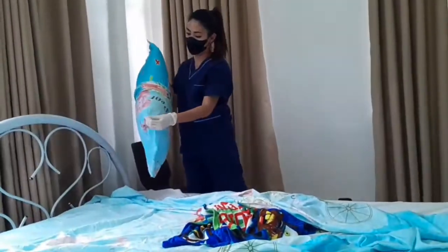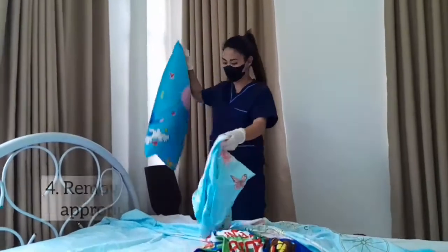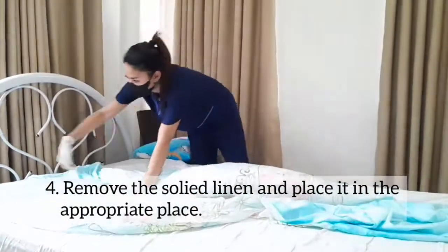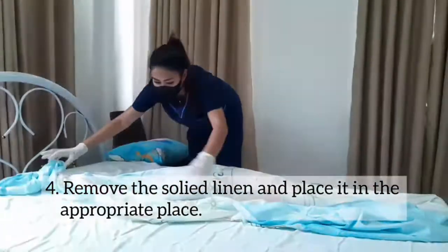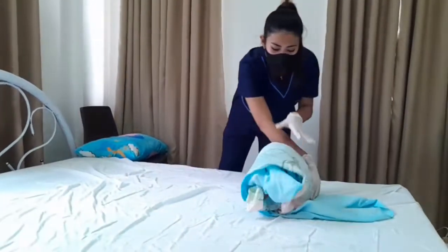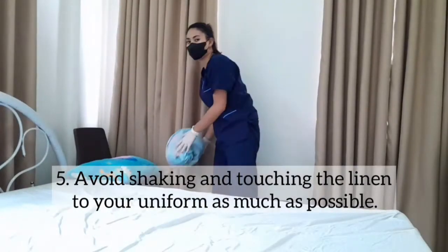Lower the bed when complete. Step 4: Remove the soiled linen and place it in an appropriate place. Step 5: Avoid shaking and touching the linen to the uniform as much as possible.